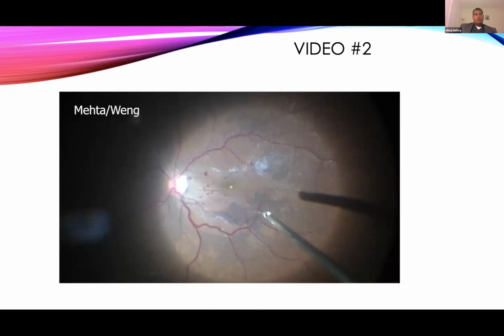Okay. But obviously it's a great peel by the fellow here, and I like what they did here, because I like to put triamcinolone in every time we do a vitrectomy, just to see where the vitreous is, make sure the hyaloid didn't split, because sometimes you'll get a schisis of the hyaloid, and leaving some of that down will help mark some of the ERM as well. And then when you put the Tissueblue on, it gives you this edge of kind of a negative stain. It highlights it, almost like marks it all out. It's like, this is where the ERM is, and outside of it is the ILM.